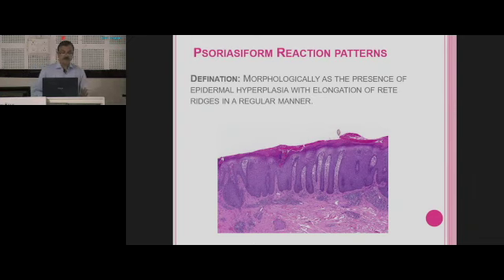Microscopically, the first thing to note is the epithelial hyperplasia with elongation of the rete ridges.